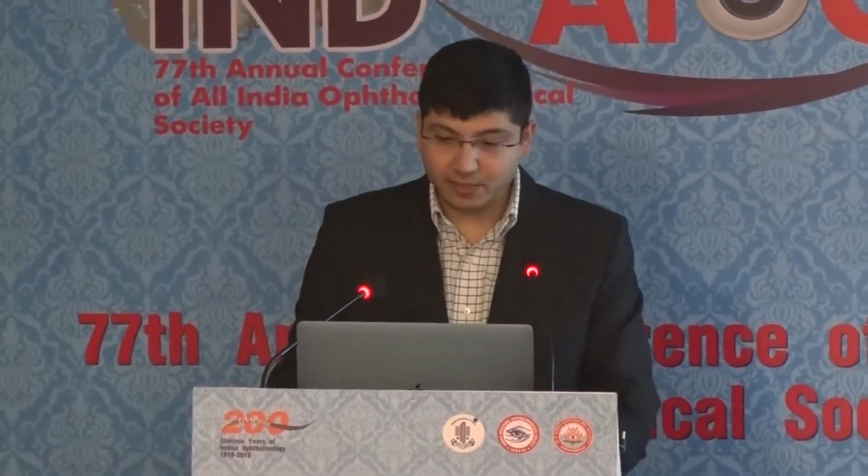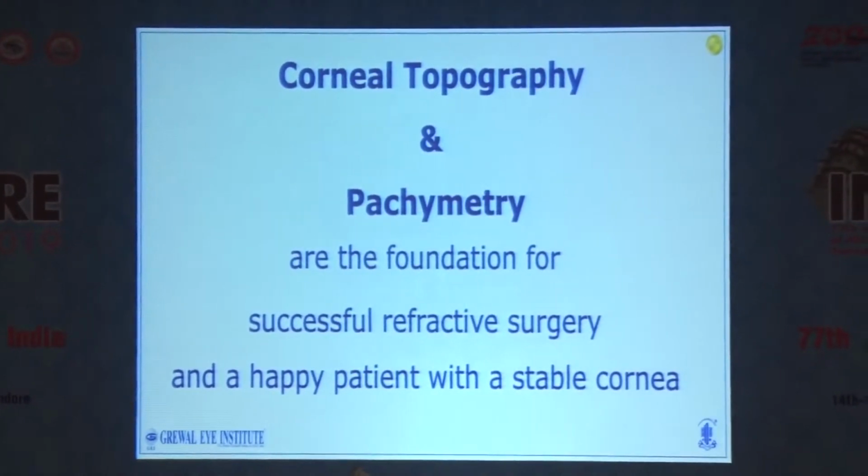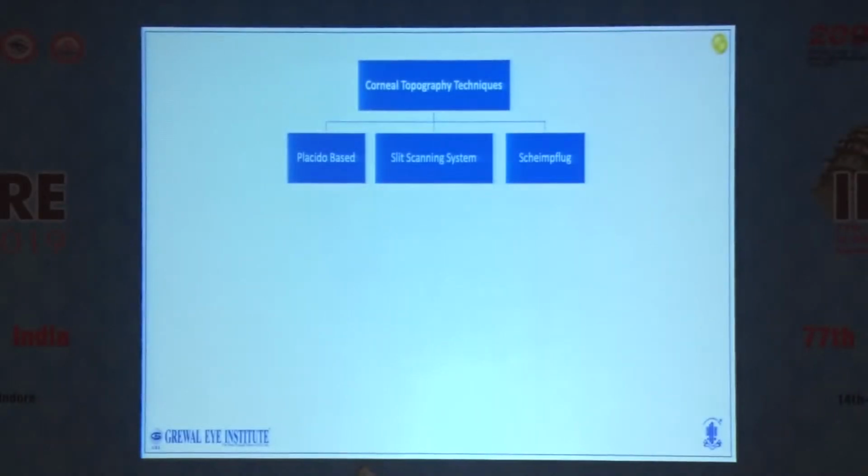Today, let's learn the approach to interpreting corneal topography and pachymetry. Corneal topography and pachymetry are the foundation for successful refractive surgery and a happy patient with a stable cornea. There are three techniques for determining corneal topography.